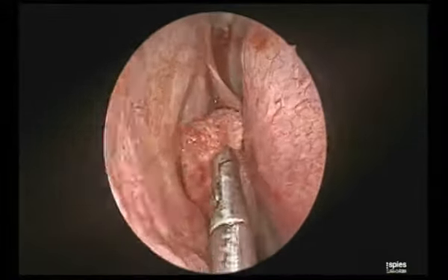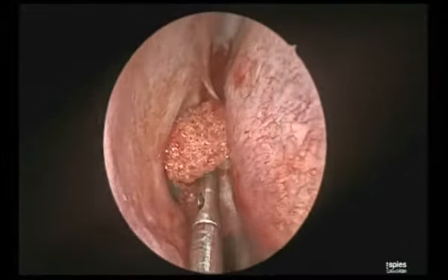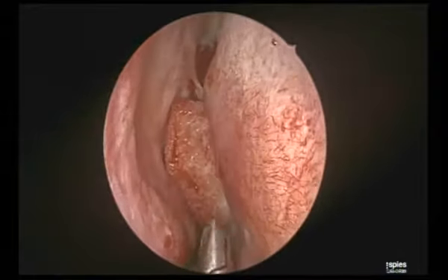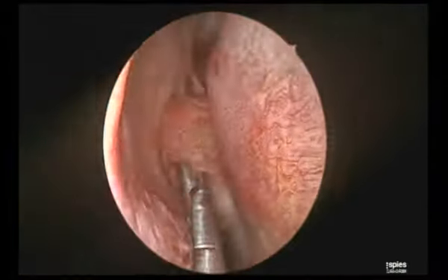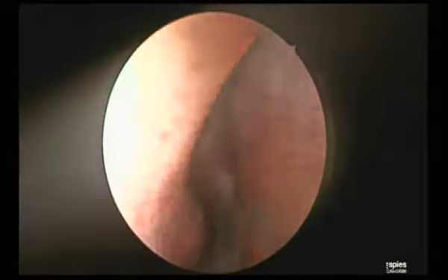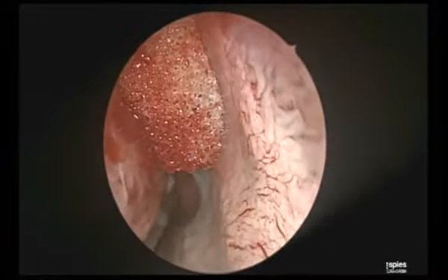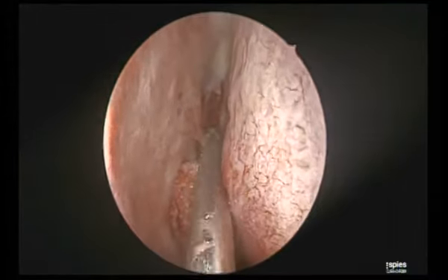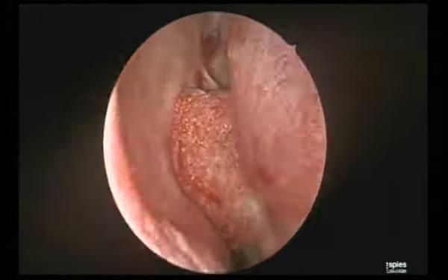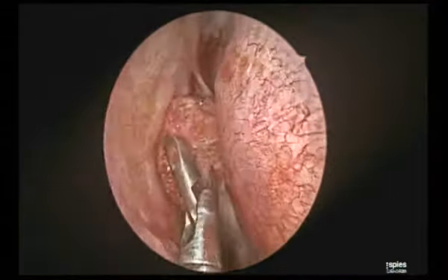Number two, as you said, it is a landmark. And number three, the channelization of the aeration is important. Once there are no air cells, what channelization are we looking at? It adds to the surface area of the mucosa, for humidification. The nasal airway is the protection of the lower airway. It acts as a gateway, by humidification, warming, filtering, all these functions. That's why if the nose is bad, the lower airway can go bad. So this turbinate has a role we should respect.